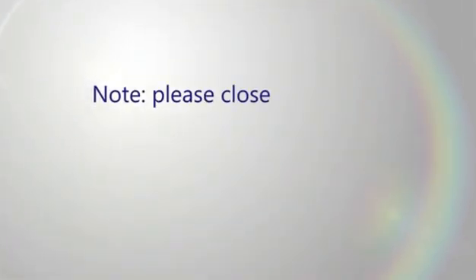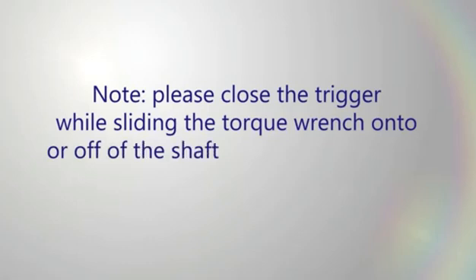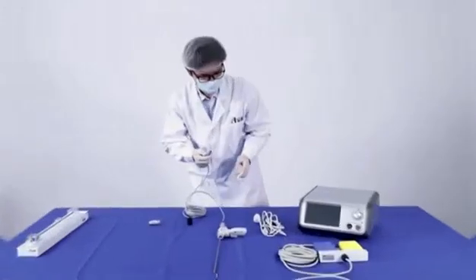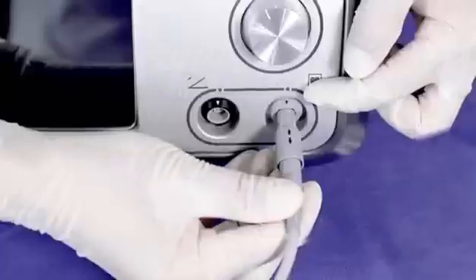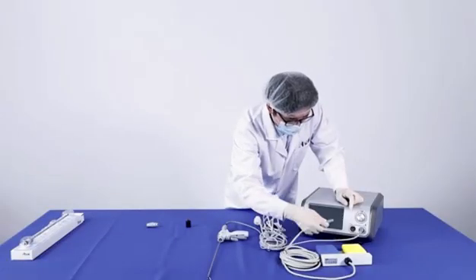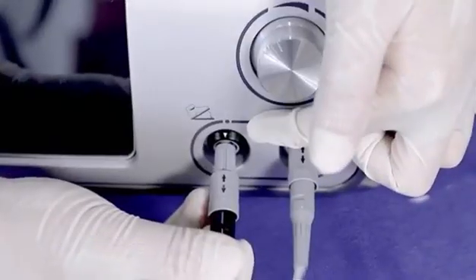Note: please close the trigger while sliding the torque wrench onto or off of the shaft to avoid any damage to the blade and clamp arm. Connect the scalpel and transducer to the generator. Make sure the arrow symbol is aligned. Attach the foot switch connector to the foot switch socket on the generator. Make sure the arrow symbol is aligned.